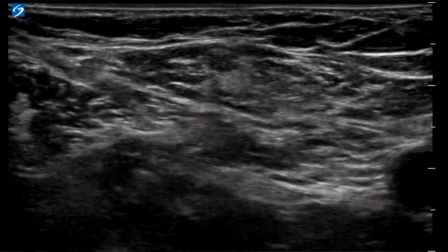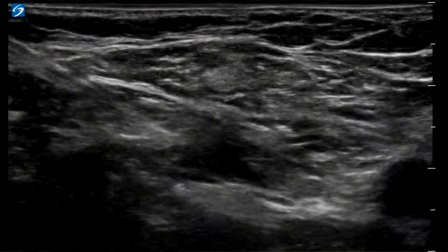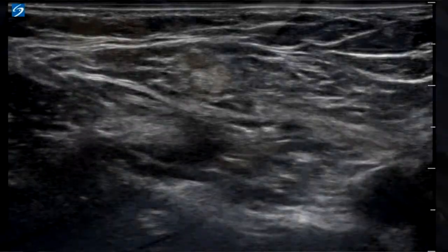Now infiltrate 15 cc's, watching for spread of the anesthetic as it continues to push the iliaca fascia superiorly. Aspirate again for safety, then infiltrate another 15 cc's.